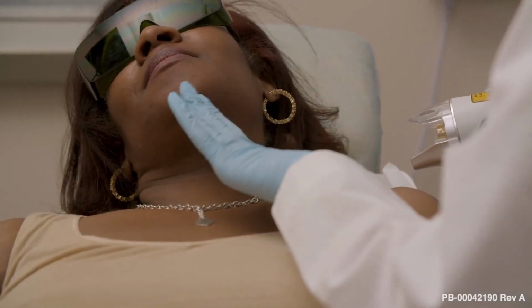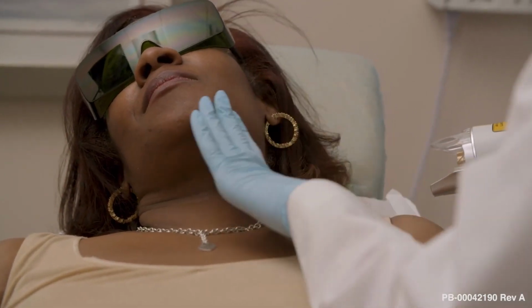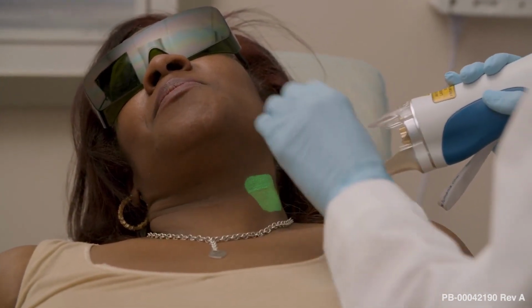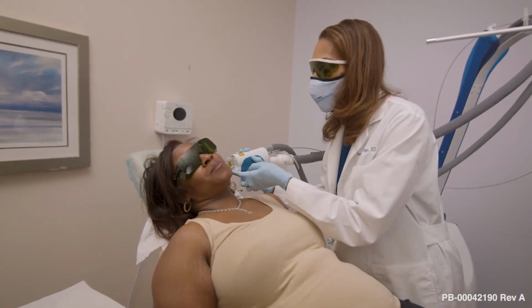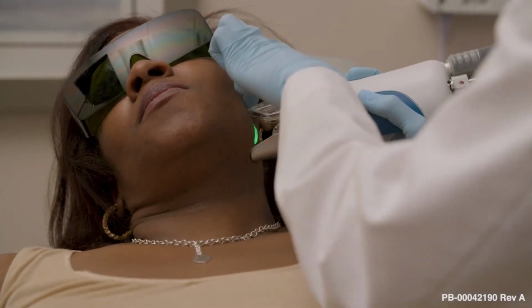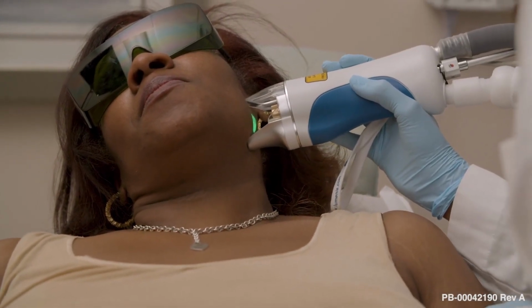It actually looks great. I don't see much hair actually, but I can feel a little bit and I can see some wisps. The place where people usually have the most resistant hair is usually right here. But as Annette told me earlier, she actually doesn't have any hair anymore. So I can use the contact cooling right to her skin, and then I can shift to make that the first area of treatment. You'll feel a little pop.